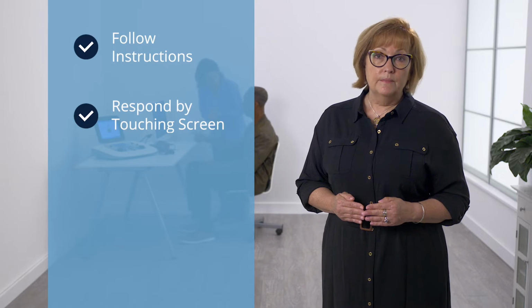Before placing the transducers, it's recommended that you inform the patient what to expect from the evaluation. Explain that you are going to place a headband and headphones on their head, and they will hear a series of beeps or tones followed by words. Instruct the patient to follow the instructions and that they must respond by touching the computer screen.